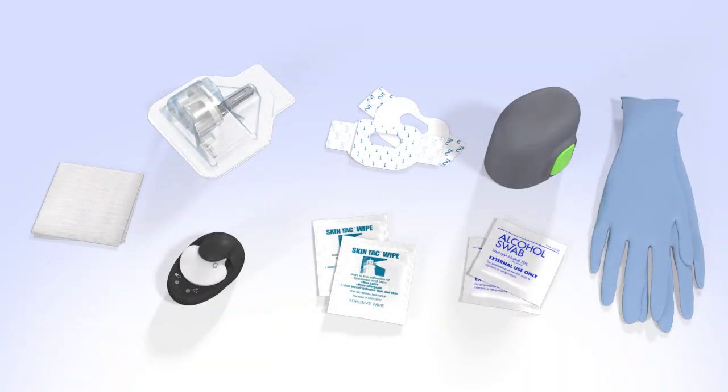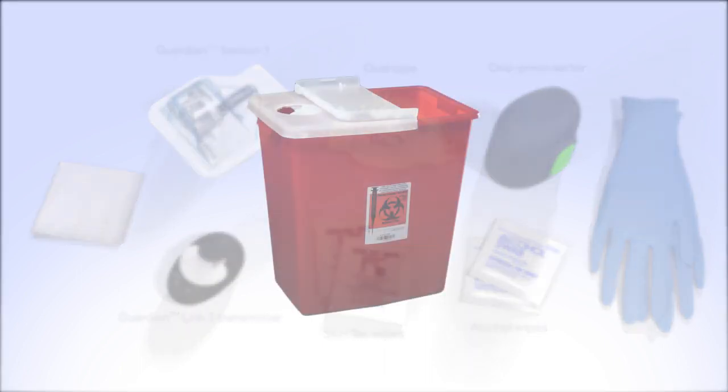When you are ready, gather the following supplies: a Guardian Sensor 3, the one-press serter, oval tape, a transmitter that has been fully charged, an alcohol wipe, Skintac wipes, any other optional off-the-shelf adhesive you plan to use, and a sharps container.